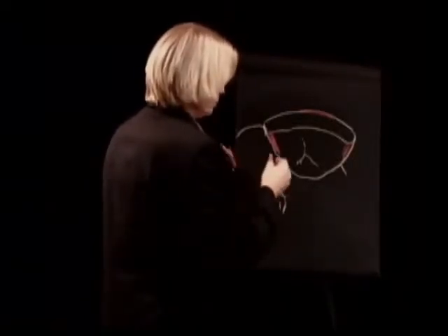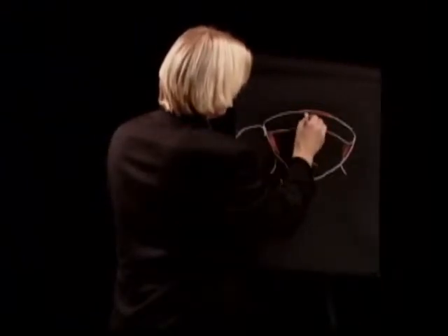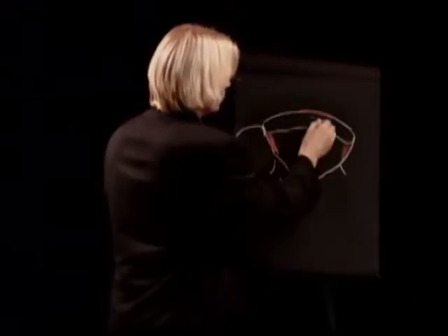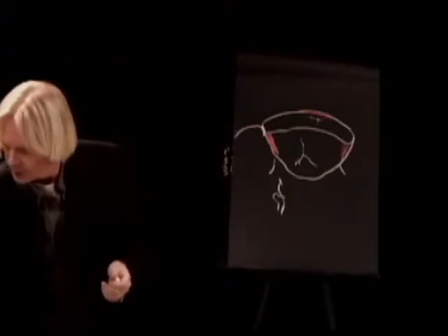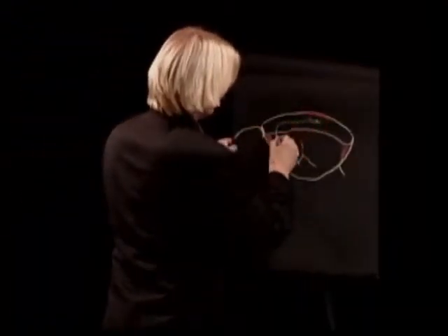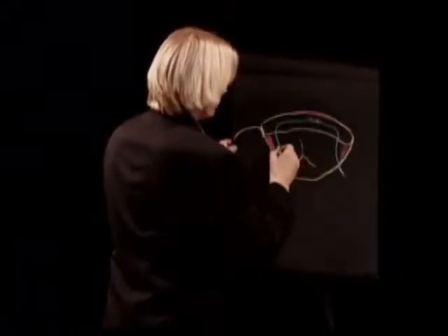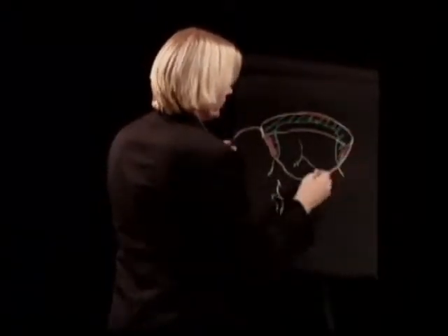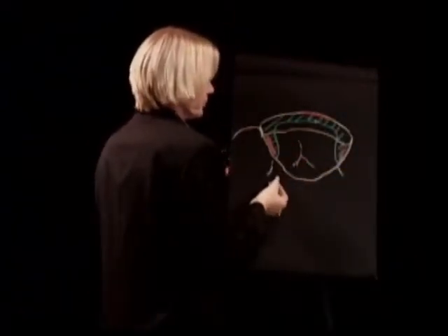So once you design the porcelain veneer, and the enamel would be a little bit thinner here because you already reduced the enamel in this area a little bit, you would have to re-establish the thickness of the porcelain veneer. And so we go to here, and then we go like this. And it would wrap around like this. And it would be called a 3/4 veneer from the top. It is a 3/4 veneer because it really wraps around the tooth by about 3/4 of the circumference.